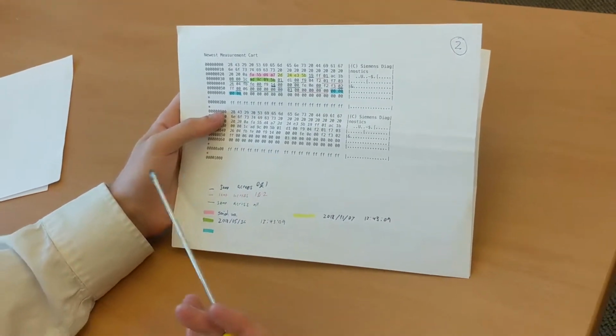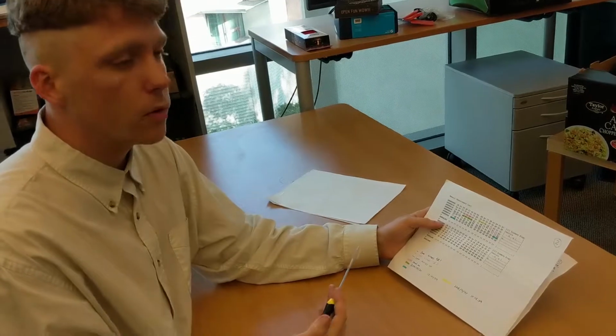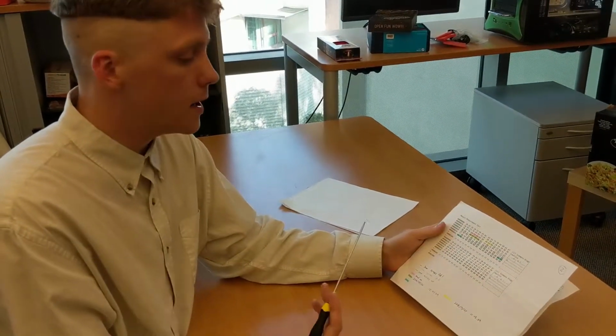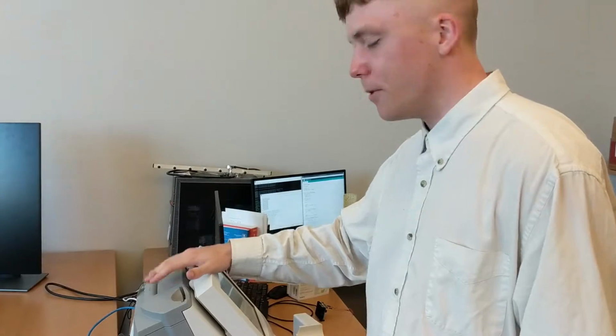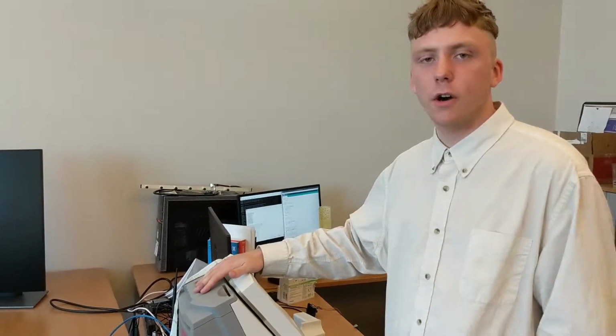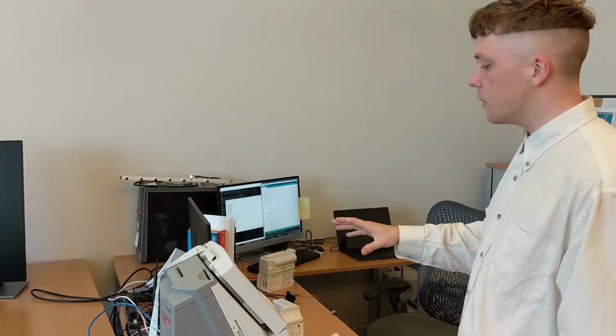The answer, sadly, unfortunately, is no. Because the serial number gets stored inside the machine, and it requires some sort of checksum. Guess we just have to give up. Or maybe not. The blood gas machine pictured here actually has a security vulnerability in the distributed component object model remote procedure call interface running on port 135. That means that we can get remote shell access to the machine in question and overwrite or look at the logs.